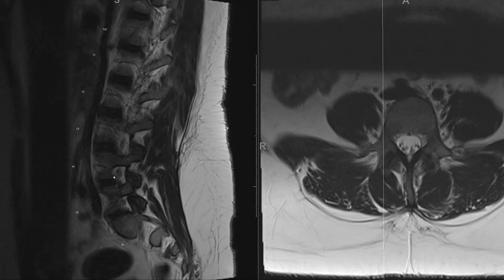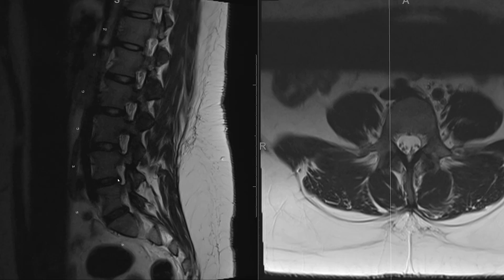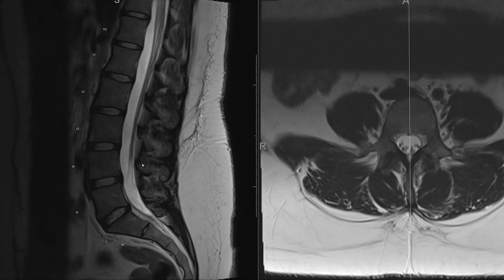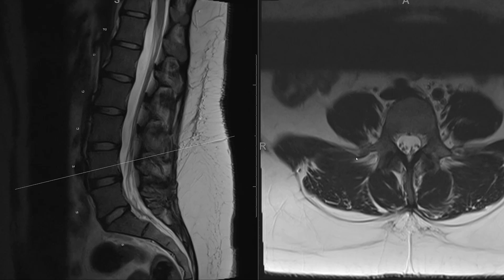Within the neural foramen, we have the endplate anteriorly of the vertebral body, the disc inferiorly and anteriorly, and then posteriorly the facet joint. The facet joint has the inferior articulating facet from the vertebral body above and the superior articulating facet from the vertebral body below.